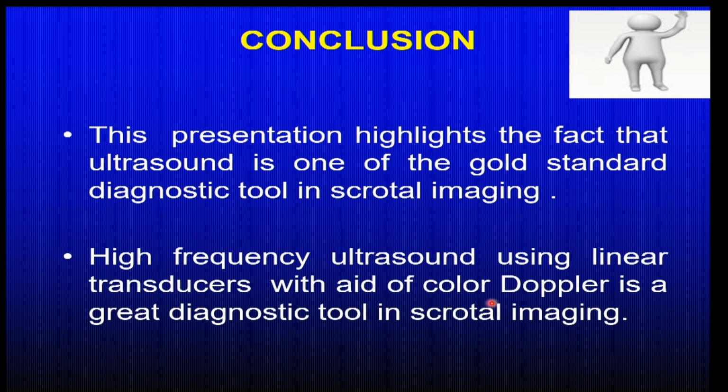If fructose test is negative, that means there is definitely a post-testicular cause of the infertility. By that I mean that there is an obstructive etiology to this patient not having sperms there. Always in those patients, subject the patients to transrectal ultrasound because that can pick up the cause of male infertility. Pre-testicular, testicular and varicocele, you can do a good evaluation by just looking at the scrotum.